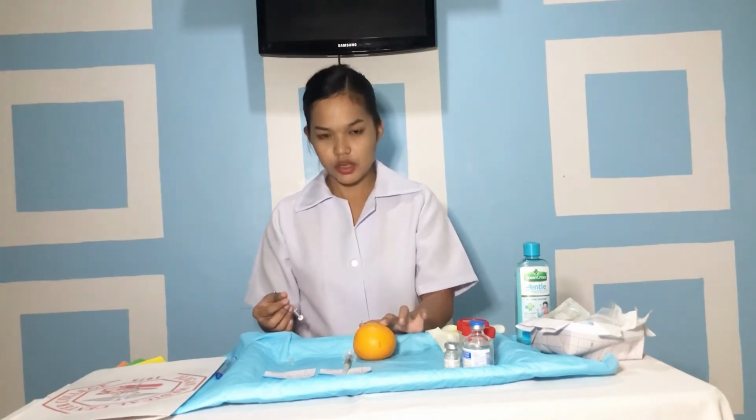So with the non-dominant hand, we stretch the skin over the site with the forearm or the thumb. So the needle pierces tight skin more easily. And then with the needle almost against the patient's skin, we insert it slowly with the bevel up at a 5 to 15 degree angle until resistance is felt.